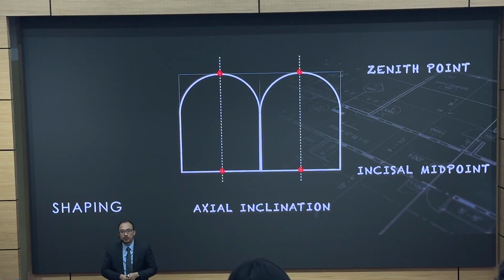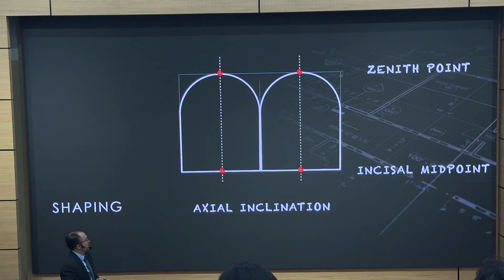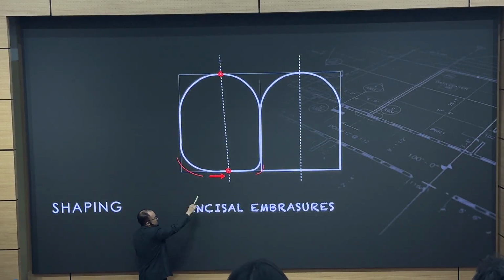You know, when you look at the front tooth, natural teeth angle inwards a little bit for all of them. So when you have a tooth that looks very square, like a tombstone, in order for me to alter the axial inclination, one of the things that we have to do is make sure that the embrasures are correct.